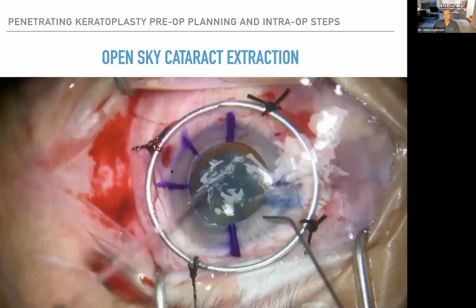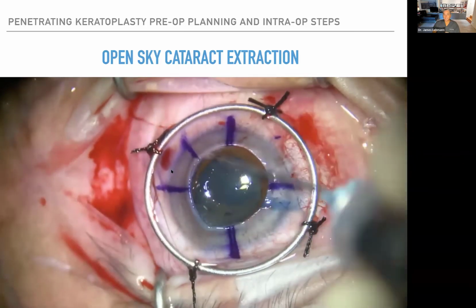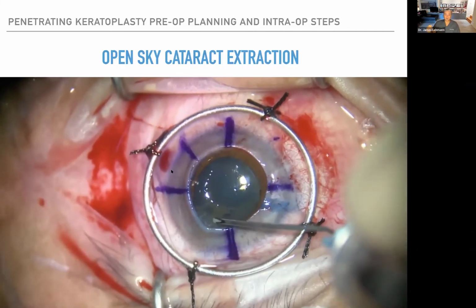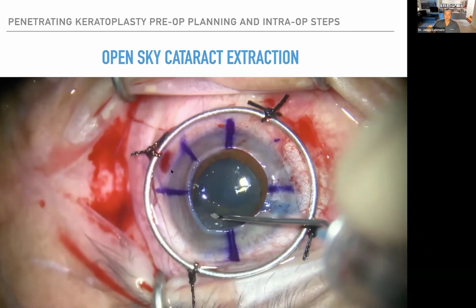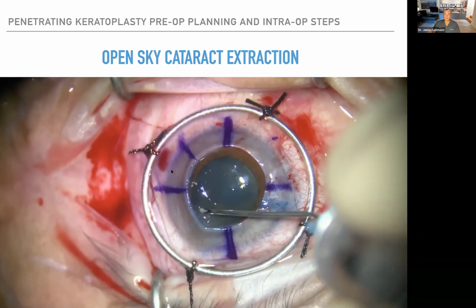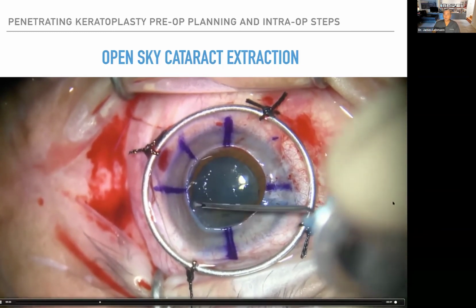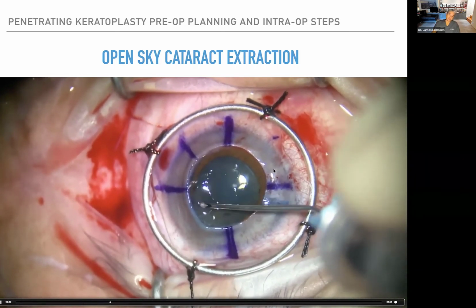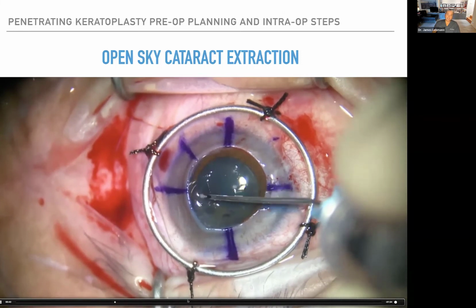I like to do a can opener style capsulotomy in these cases. I used to try to phaco it. I used to try to do a CCC, but it's more work than it's worth, and it takes time. So I'm just doing a can opener style capsulotomy like you would if you just do an old school extracapsular cataract surgery. And you just go around all the way.